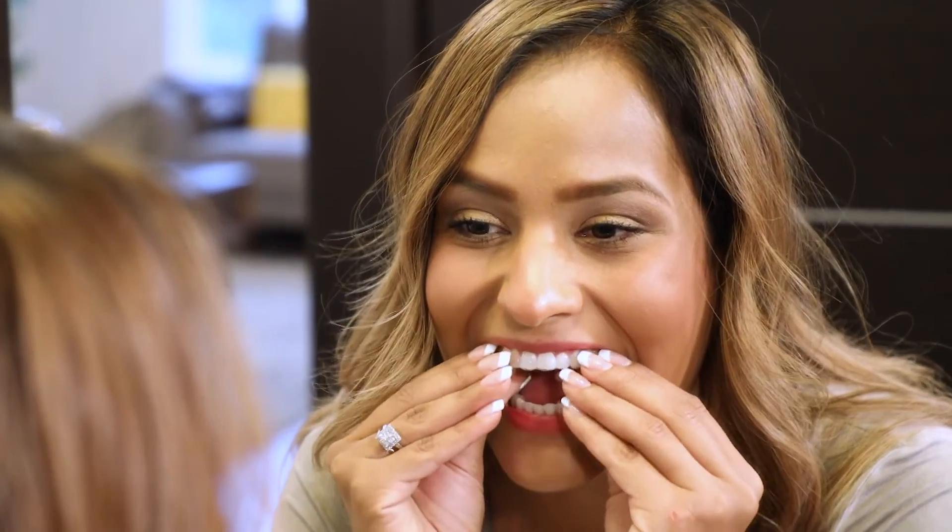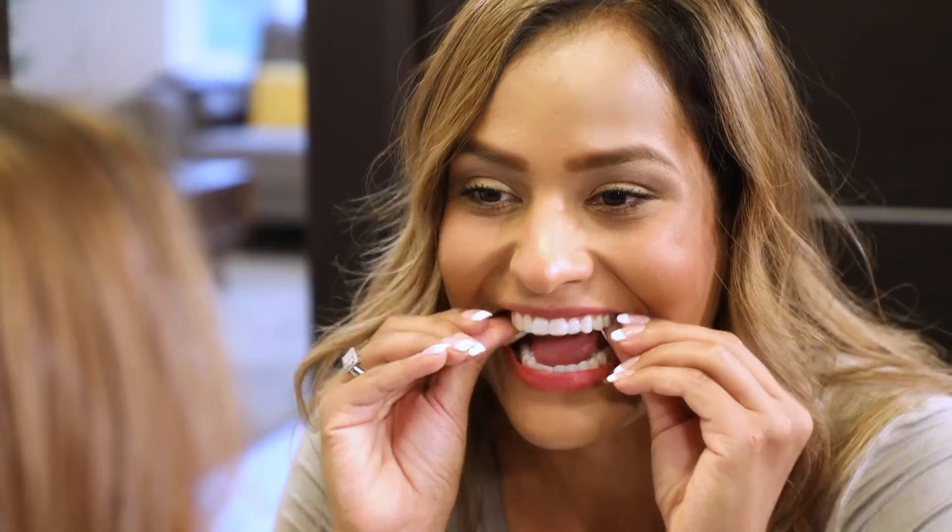Place the tray over the teeth and carefully press the tray into place. Gently wipe off any excess gel with a soft toothbrush.